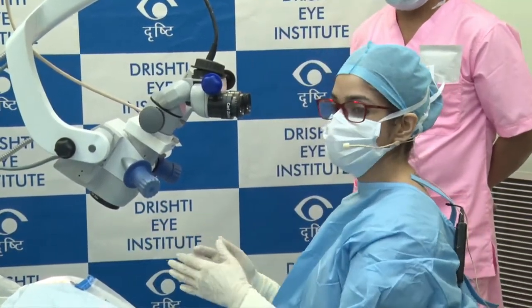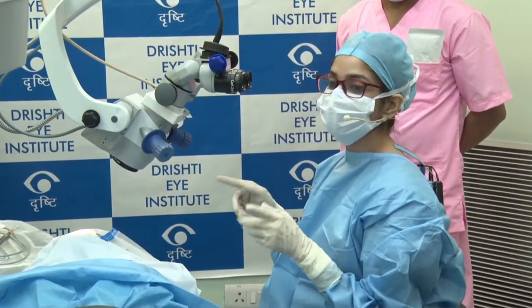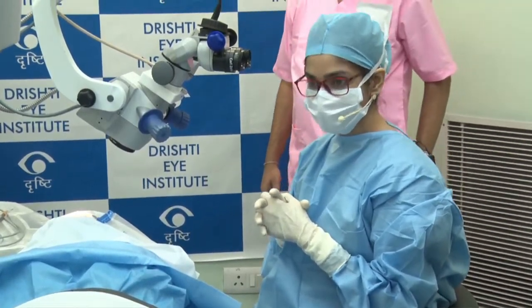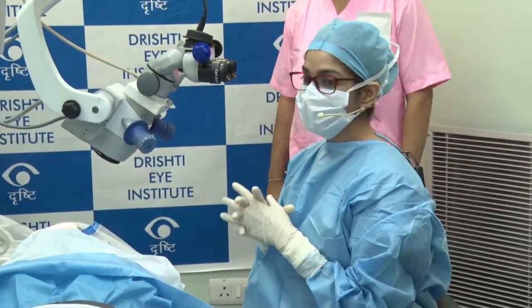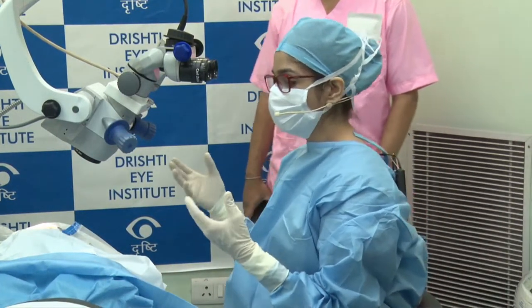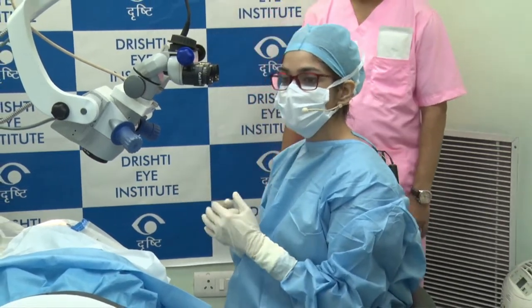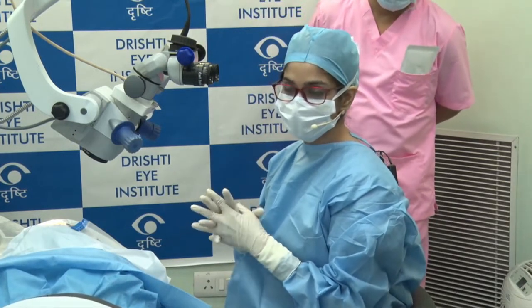Then you put the prism, you sit temporally always, and you're supposed to treat the nasal half of the angle. The two stents ideally should be placed about 2 clock hours apart from each other. That's what we achieved here also. Reflux heme is very normal. After the procedure is over, you put the patient back to position zero and the microscope to position zero to clear out all your cohesive viscoelastic, and then you close up the case.